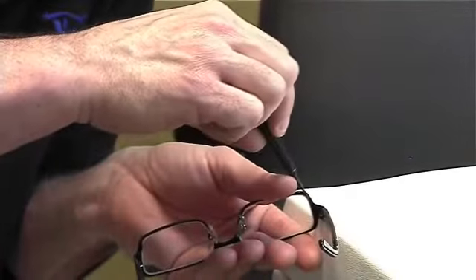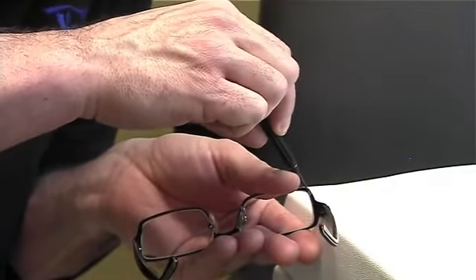And now we have tightened up the screws, and that's how we tighten glasses with the screwdriver.